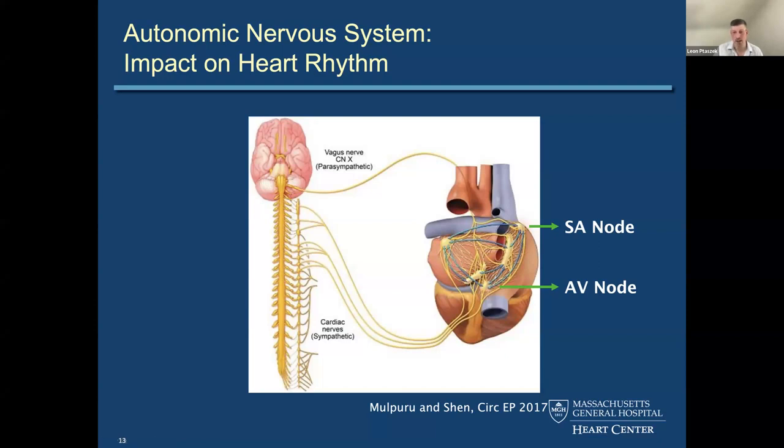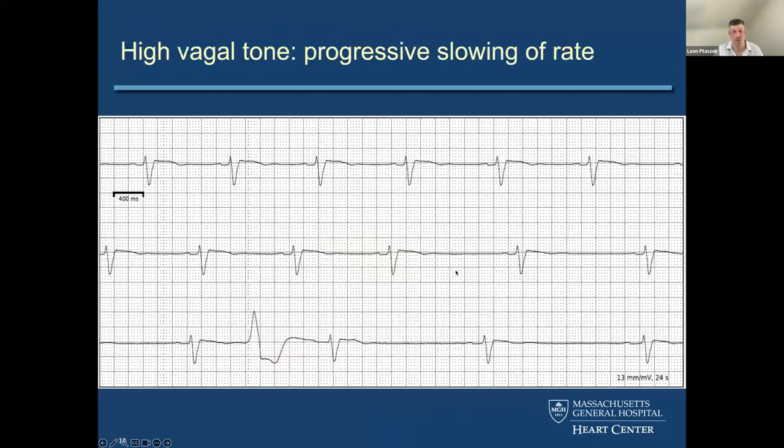And what you would expect to see with typical neuromodulation of the heart is this smooth change in PP intervals, and sometimes even a change in AV intervals, but it's the smoothness that you're looking for. So it could be that in that last tracing I showed you that it was true sinoatrial block, although we really can't rule out the possibility that it's normal sinoatrial node function in the context of additional parasympathetic tone impacting both the sinoatrial and the AV nodes.